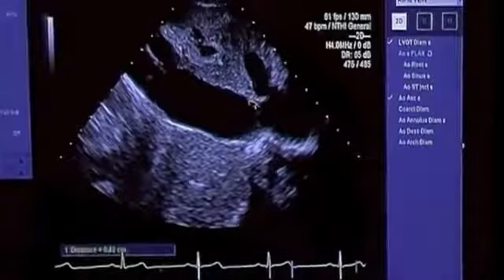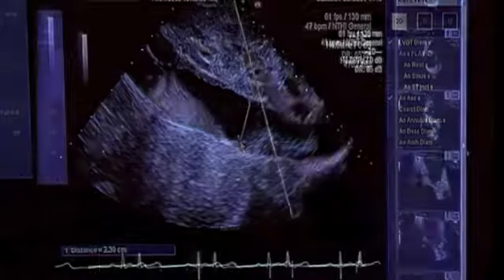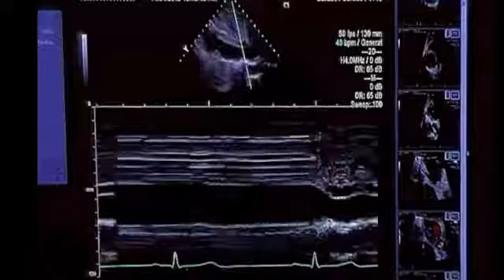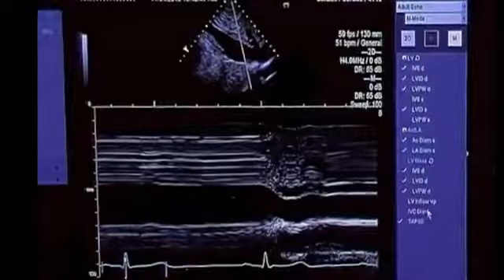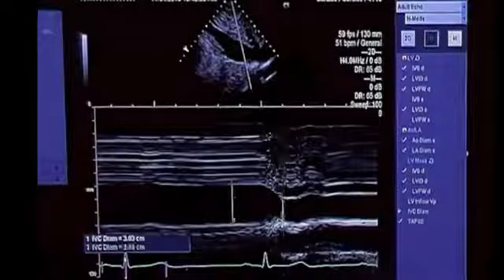You can measure the size of the IVC, usually at about 1 centimetre proximal to the hepatic vein. You can estimate the right atrial pressure in a non-ventilated patient by determining not only the size, but the variation in the size with respiration or a quick, short, sharp sniff.